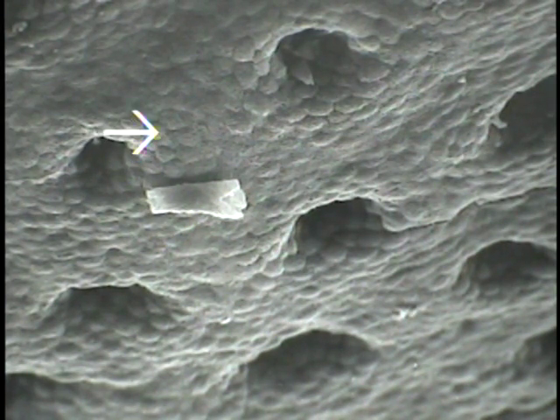One can also visualize, with close observation, the apices of individual cells. These are the tops, or the apices, of that simple columnar gastric lining epithelium that surfaces the entire stomach and actually forms the invaginations and lines the circumference of the gastric pits, as you can see just going down in. So this is a surface view, looking at the surface of the stomach with a scanning scope, demonstrating the orifices of the gastric pits, or foveolae.